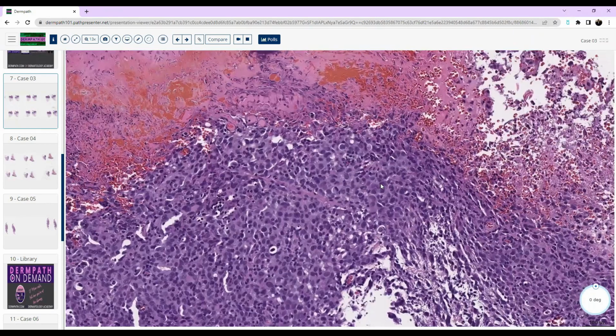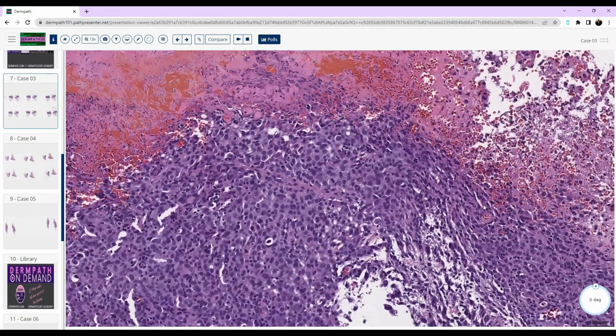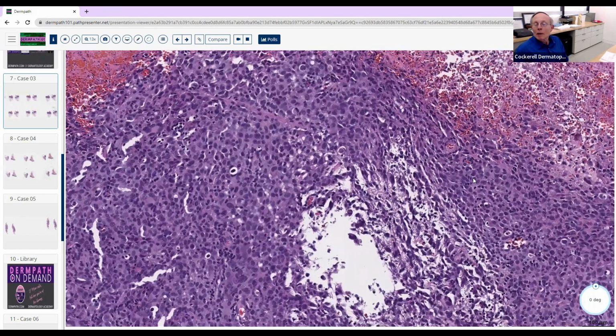Like a mastocytosis, or, well, epithelioid sarcoma is the thing I was thinking of. If you do a biopsy of something that looks like a granulomatous dermatitis, it looks like GA histologically. And then you look at it, it looks like a palisaded granuloma. What's really happening is you've got a neoplasm that's undergone a central area of necrosis, and it gives you a pseudo palisaded granulomatous process. And you look at the periphery, you can see the cells are really kind of atypical, but they look like histiocytes because they're epithelioid histiocytes.